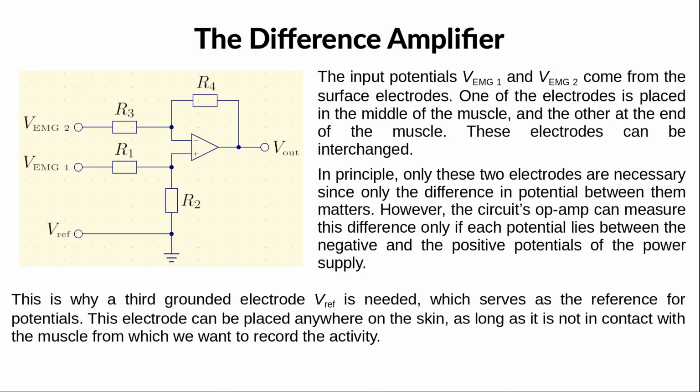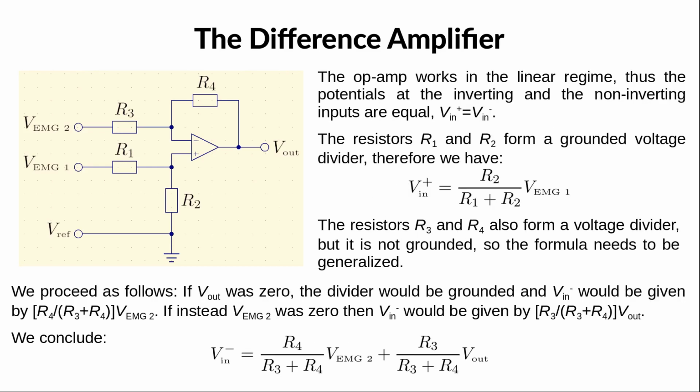This is why a third grounded electrode is needed, which serves as the reference for potentials. This electrode can be placed anywhere on the skin as long as it is not in contact with the muscle from which you want to record the activity. The OpAmp here works in the linear regime, which implies that the potentials at the inverting and the non-inverting inputs, Vin minus and Vin plus, are equal. Once again, if you don't know where this statement comes from, check out my tutorial on OpAmps.